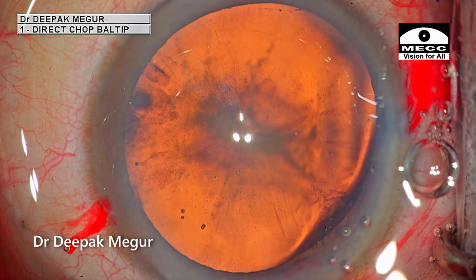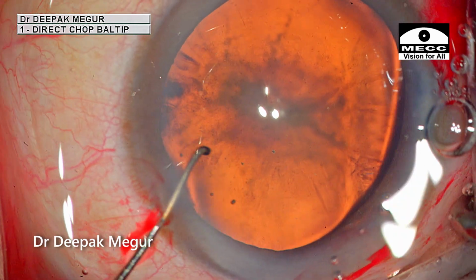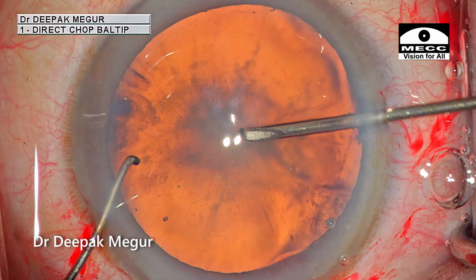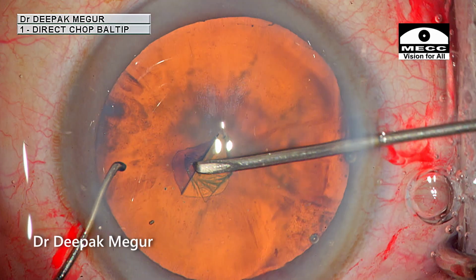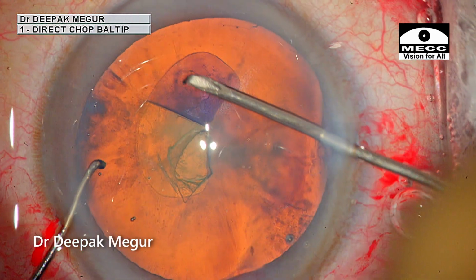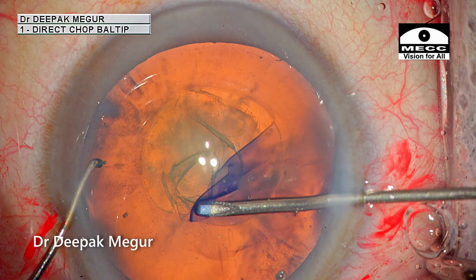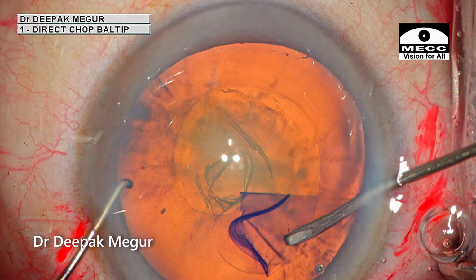It's important for me to stabilize the globe with some instrument in my second hand. In this case, I'm using the Sinskey hook to stabilize the globe. The patient is asked to look at the light. The capsule is punctured with the needle, and then it is folded on its own, and then the tearing is begun in a circular fashion. This is how I do it when I'm using a needle, and this is clockwise, which is not the usual way which is usually taught. But this is the way I have learned it, and I most often do this clockwise tearing of the rhexis.